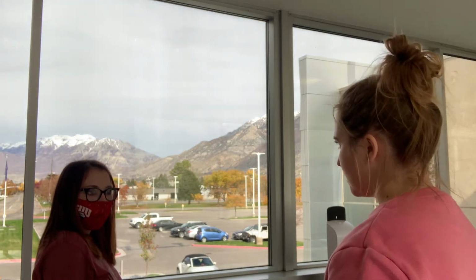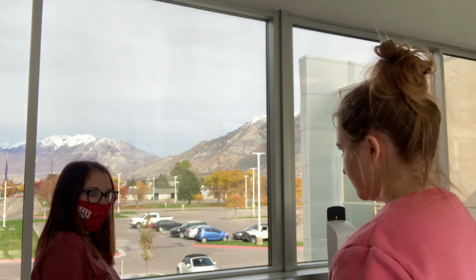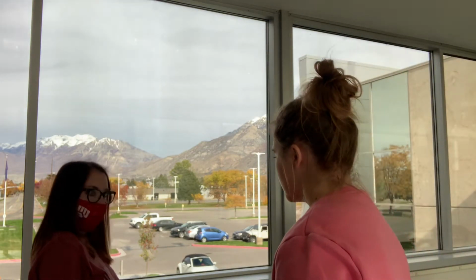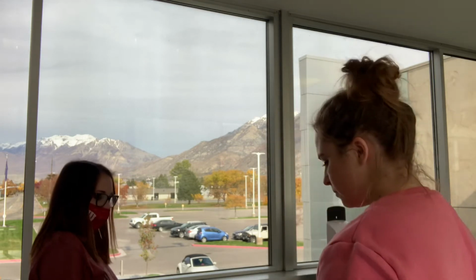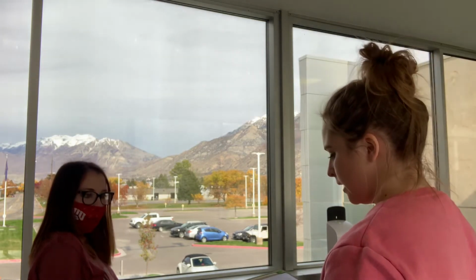You don't have a pacemaker or active implant anywhere near your knee. Are you pregnant? Okay. We're not putting this over the neck or anything, so carotid sinus isn't a big deal. You have normal sensation here in your knee. You can feel when I touch your knee. And have you ever been diagnosed with impaired cognition? Okay.